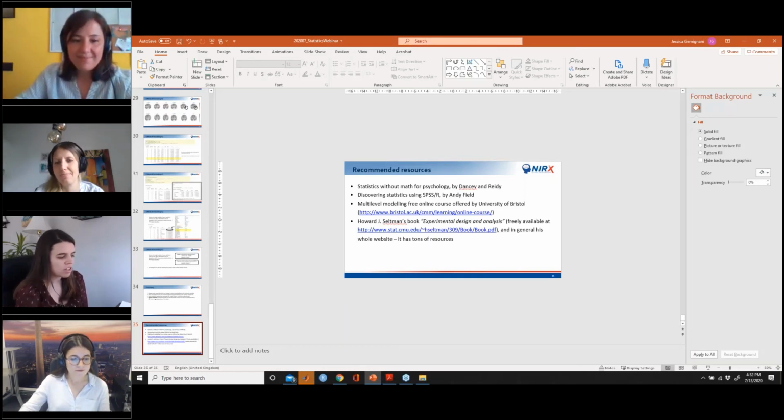I will take the next question. So this question is, could you also say some words about how to specify covariates in the first level, especially in order to account for an equal number of observations and the time sampling? Is that a clear question? Yes, I see what you mean.